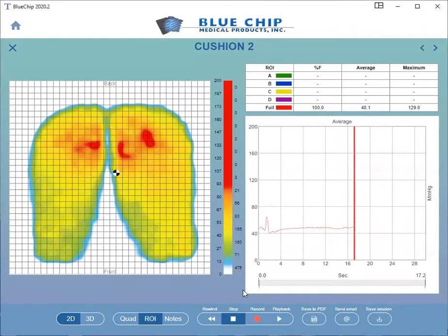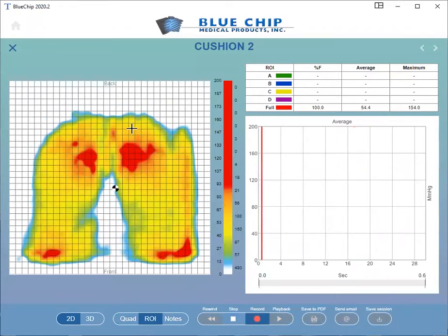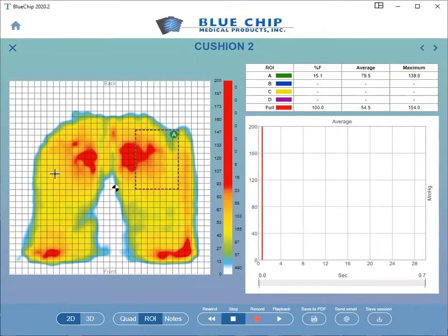Click the Regions of Interest button at the bottom of the screen. Your cursor will change to a cross, which will allow you to click and drag to create a region of interest.